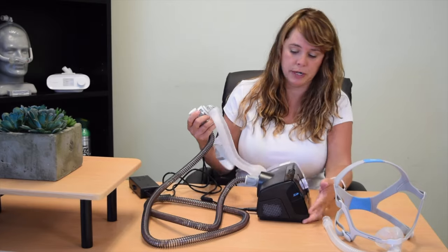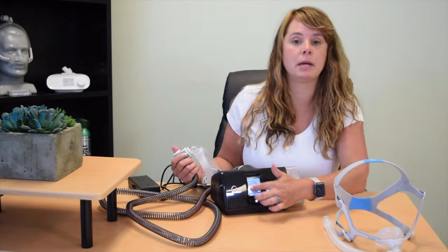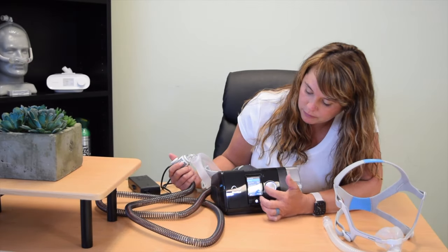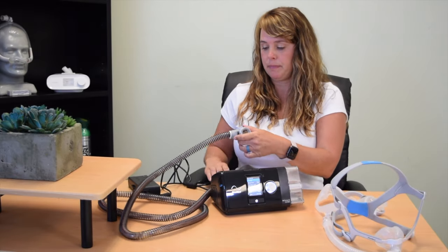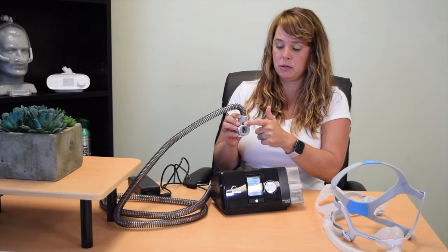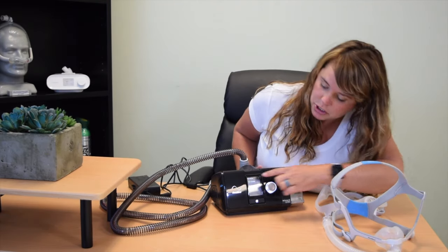Also on the screen, if you were to go into your options, you are not going to find climate control, which normally if your tube is connected correctly you would find. All you see is a humidity level. My tubing is backwards — I'm going to fix that by connecting it correctly using the connector in the back of the device. And the machine is going to show me that my tubing is now connected correctly.